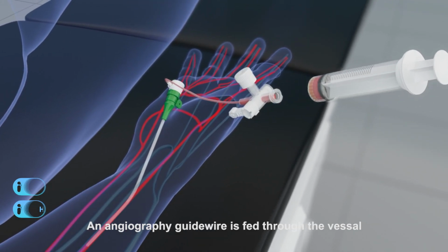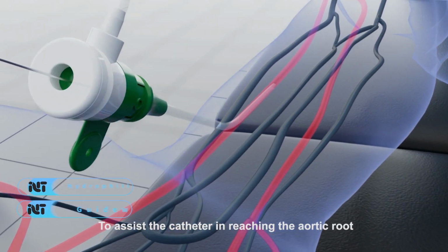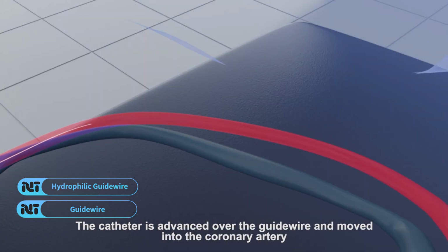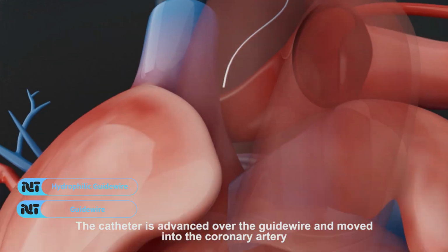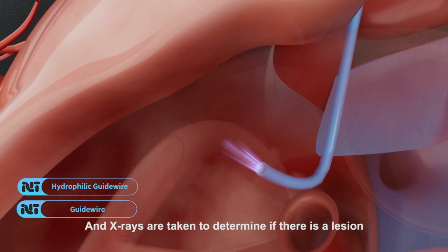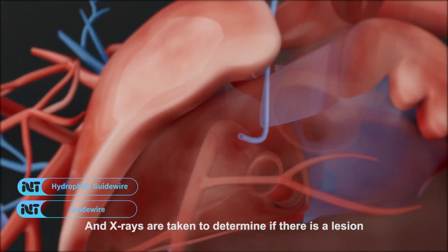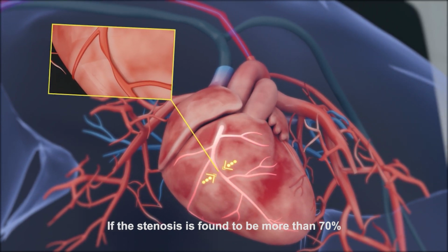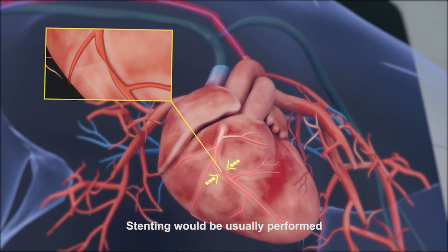An angiography guide wire is fed through the vessel to assist the catheter in reaching the aortic root. The catheter is advanced over the guide wire and moved into the coronary artery. Contrast agent is injected into the artery and X-rays are taken to determine if there is a lesion. If the stenosis is found to be more than 70%, stenting would usually be performed.